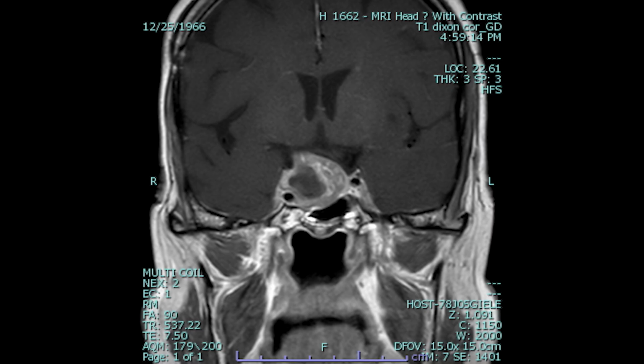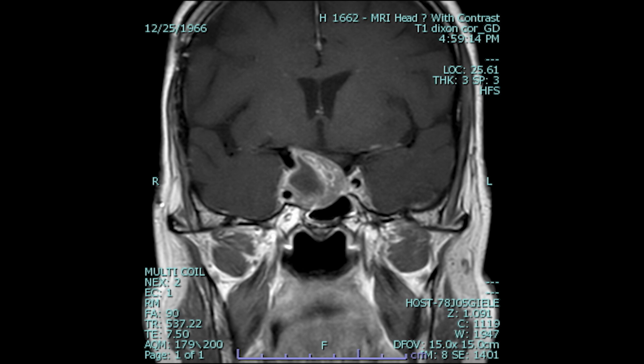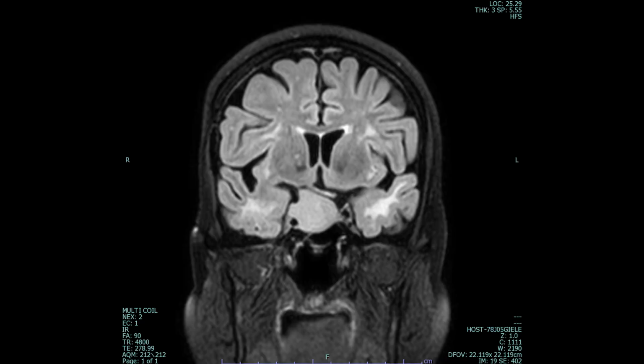This is the MRI scan of a patient who has presented to us with a large pituitary macroadenoma, or a sellar mass, so to say. This patient has a history of surgery 20 years back through the transcranial route on the right side for a pituitary lesion, post which he developed right side complete blindness. Following the surgery, he underwent radiation therapy for the mass as well. Now, this patient presents with left sided blurring of vision as well as progressive headache for the past 2 years.